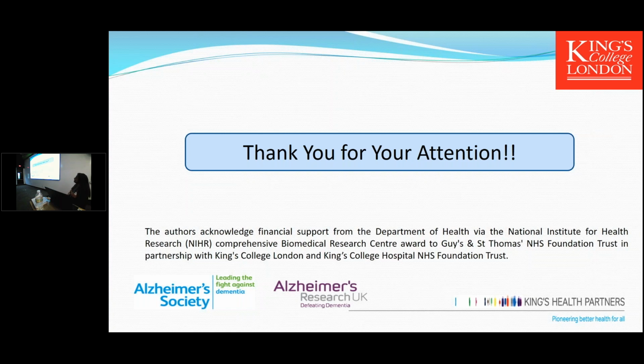I think we had high uptake initially in the first 30 minutes. I can't quite remember how the washout was after 24 hours, but I think there was quite high washout in wild type. And I think the only organ of significance that seemed to retain copper at 24 hours in the disease animal was lung, which was unusual. The washout in both disease and wild type was quite similar. They both came down because obviously 30 minutes is very quick after the injection. But lung was the only one that had a significant difference, with higher copper in the diseased animal, and we don't really know why that is.